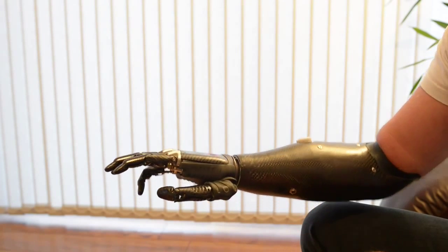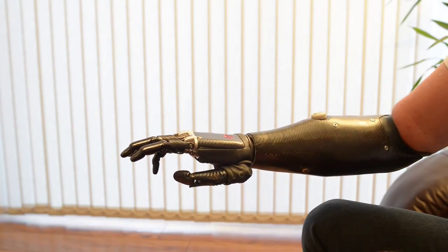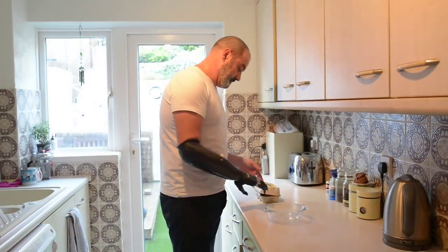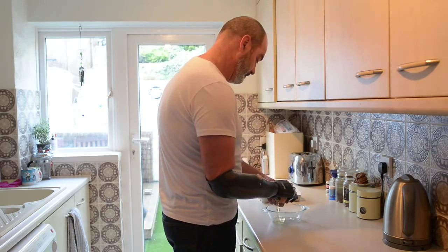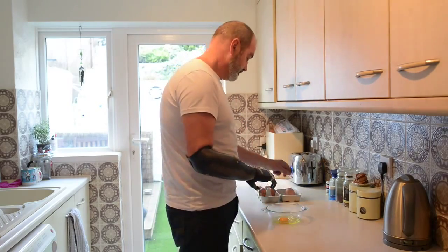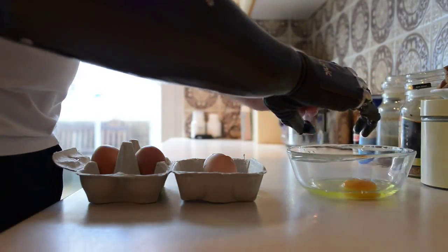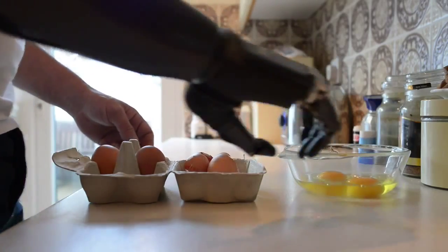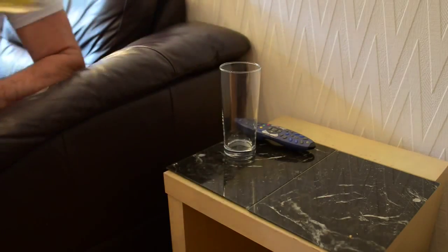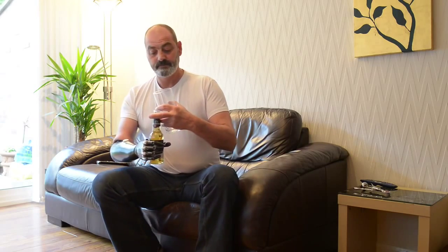And then we have a mouse grip. This will hold a mouse — single click, double click. They're developing this now so that soon you'll be able to drag and drop. Now I'm going to press the button.